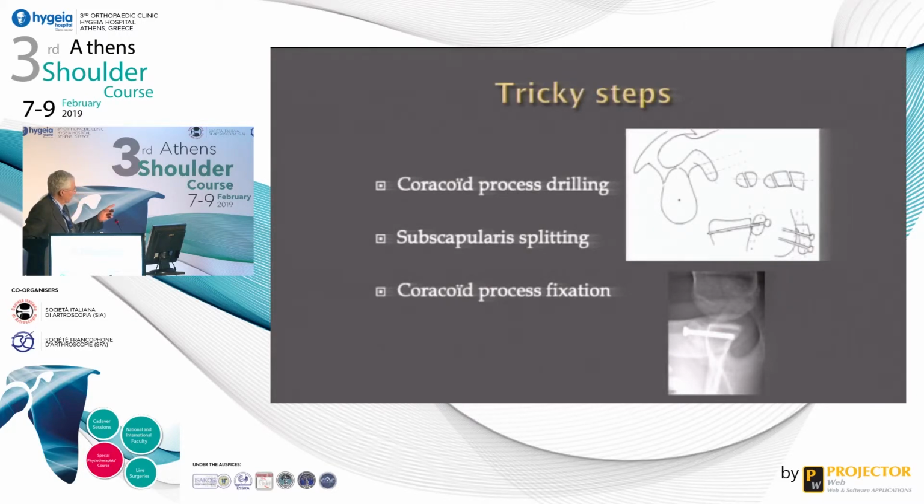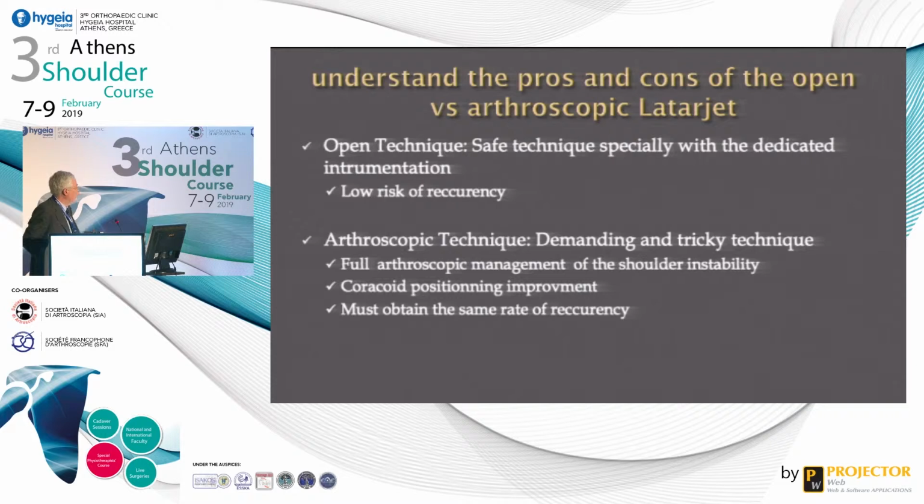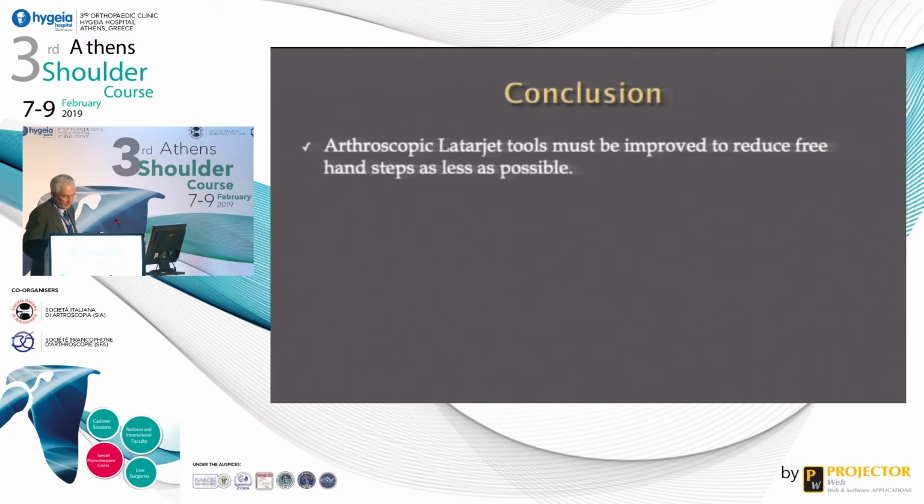The tricky steps are the coracoid process drilling, the subscapularis splitting because you need to be safe regarding the nerve, and the coracoid process fixation because you need to be very, very parallel to the glenoid surface. Arthroscopic technique is a very demanding procedure, and you need to improve the tools as much as possible to make a safe and reproducible procedure, because that is a big problem.